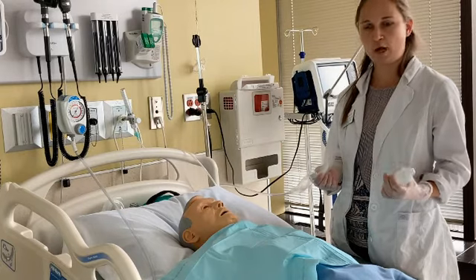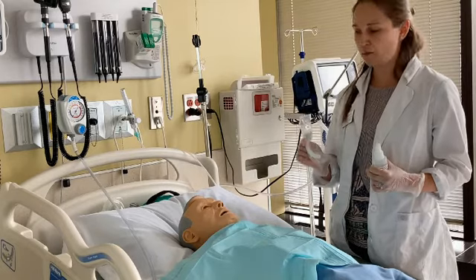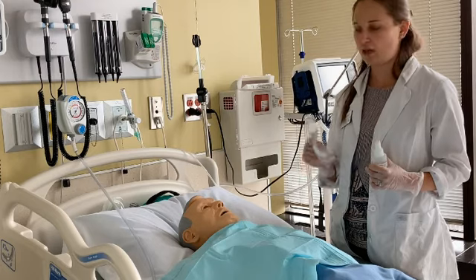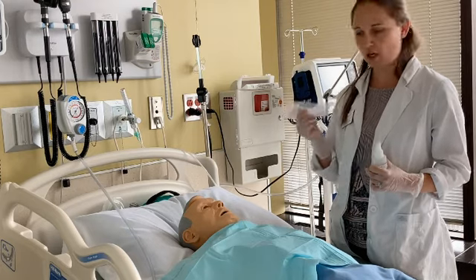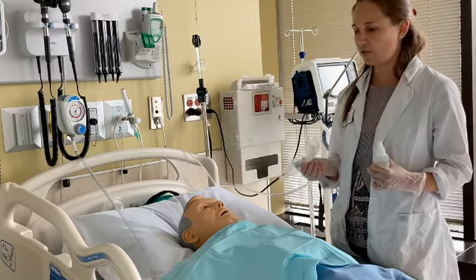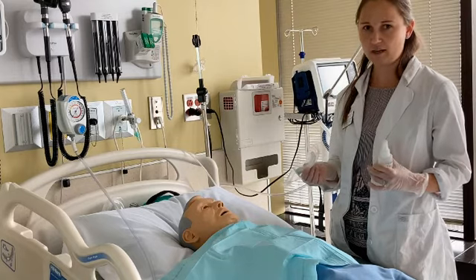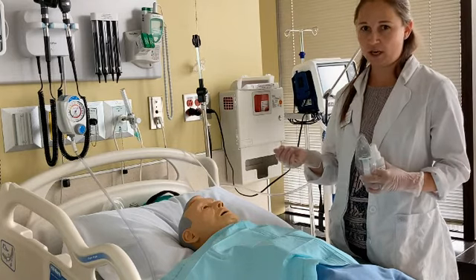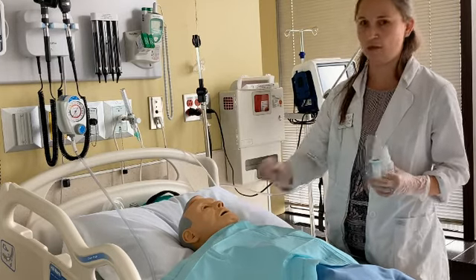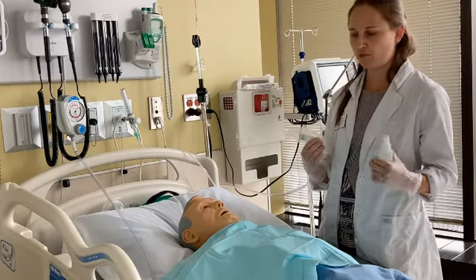And why would I choose one over the other is because the oropharyngeal airway stimulates the gag reflex in the patient. So if this patient is somewhat alert and conscious, I cannot insert this airway because this can actually cause them to vomit. So what I would do first is I would actually check if the patient has a gag reflex. I could just take a tongue compressor and check for gag reflex by just putting a tongue compressor in their mouth.